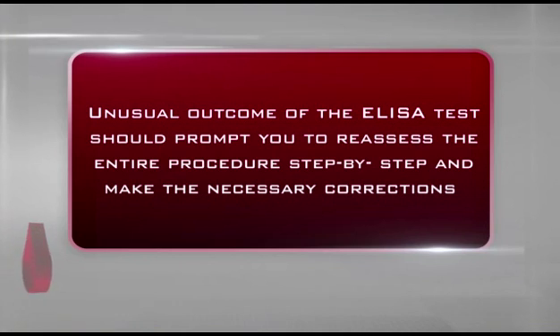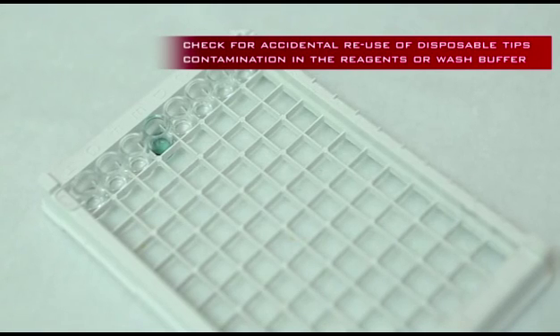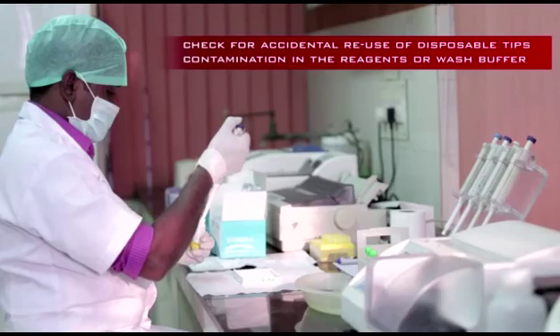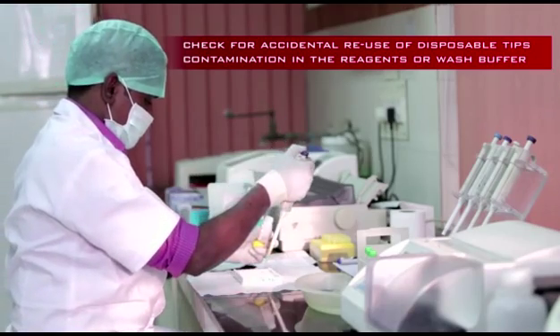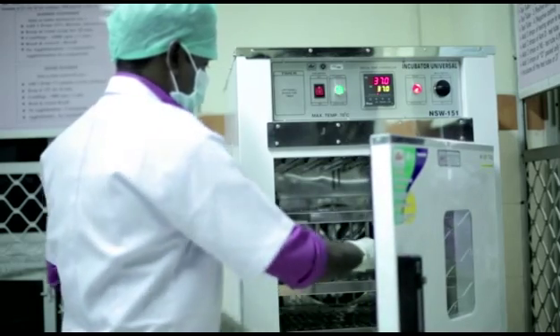Unusual outcome of the ELISA test should prompt you to reassess the entire procedure step by step and make the necessary corrections. For example, if there is a high background color, check for accidental reuse of disposable tips, contamination in the reagents or wash buffer, improper washing or inappropriate incubation.